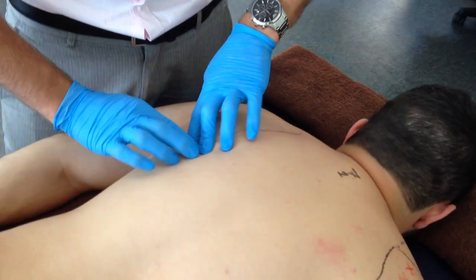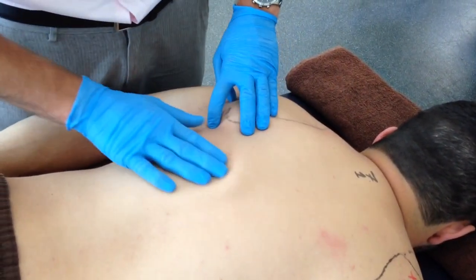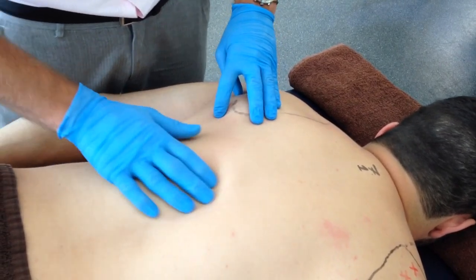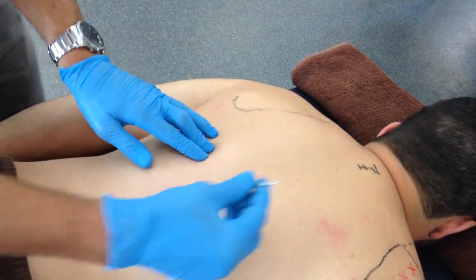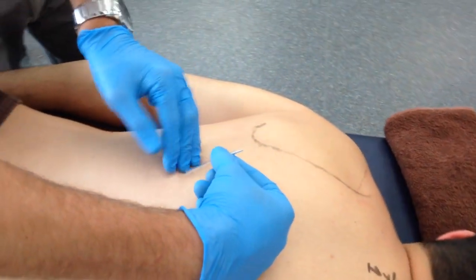With the patient again in a prone position, with the arm resting by the side, the trigger point taut bands in the lower fibres of trapezius can be palpated for. The area can then be needled at an acute caudad angle. This superficial method should again reduce the risk of pneumothorax.